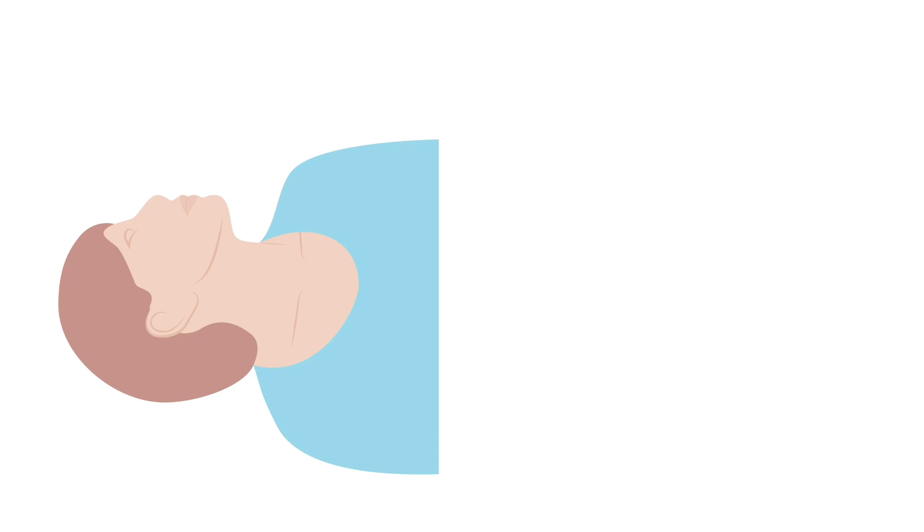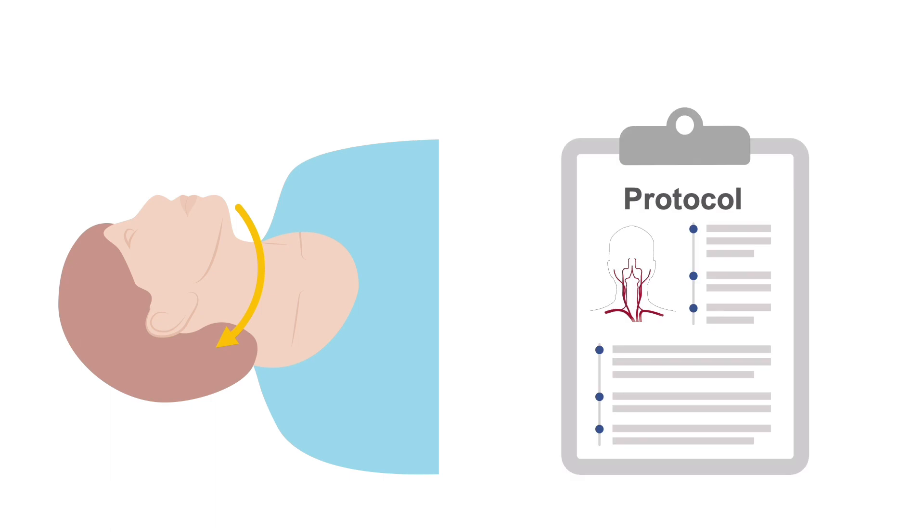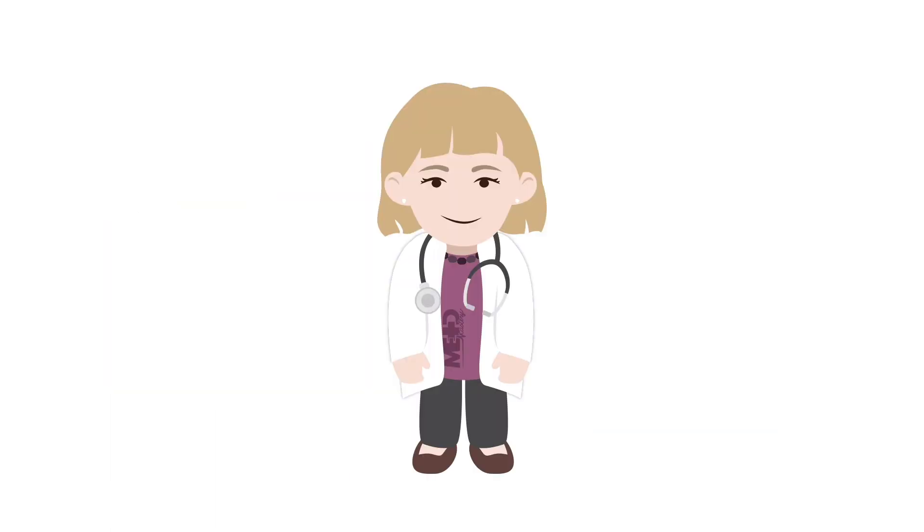Once the scan of the right side is complete, the patient should be asked to turn their head to the right and the left side of the neck should be investigated following the same steps. Following a set protocol and using a methodical approach will ensure that you have performed a detailed investigation of each vessel.